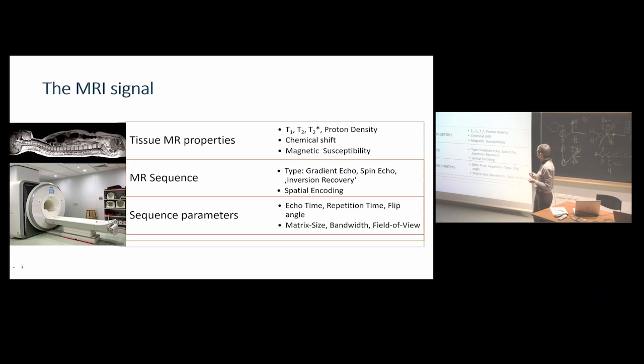We will have a look at the spin echo, and we will look at the gradient echo. That determines the main behavior of the hydrogen inside your measurement. It will also depend on how you change the settings of these sequences. When you change the settings, you can completely change the type of signal that you observe. So this gives another degree of freedom for our measurements.